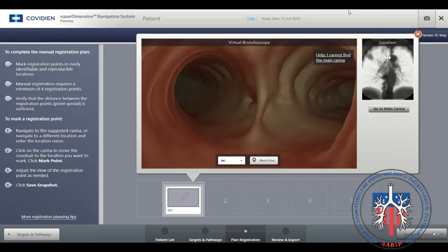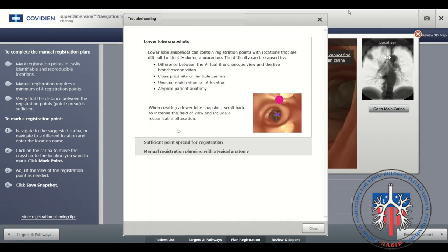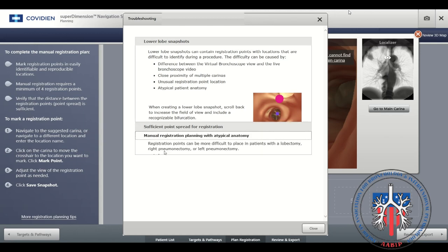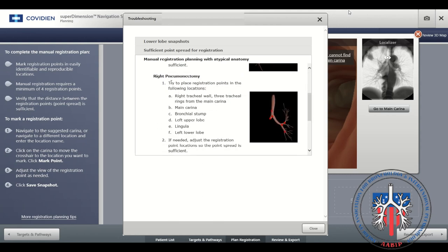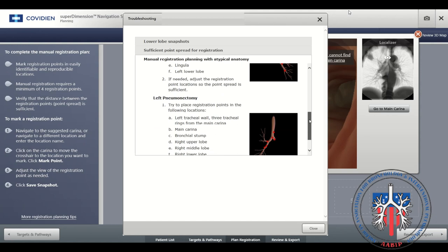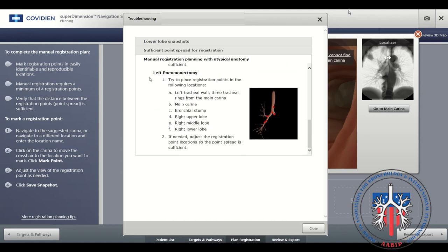Next, select the gray tab Plan Registration. This step of manual registration is not necessary, as registration is achieved automatically. This is done in case there is a failure in registration or there are special circumstances that require manual registration. The hyperlink 'More Registration Planning Tips' provides information on atypical anatomy, such as lobectomy, right pneumonectomy, or left pneumonectomy.